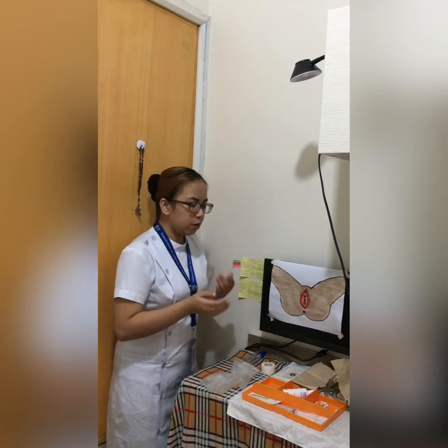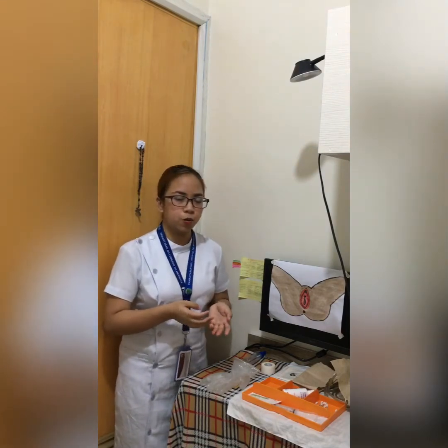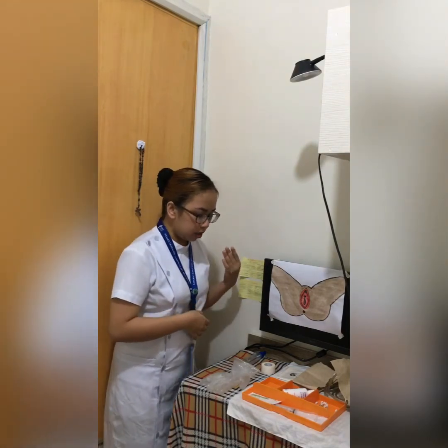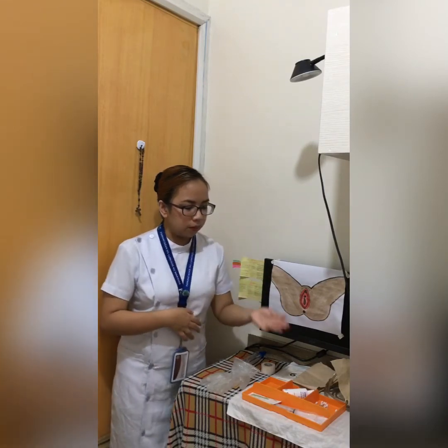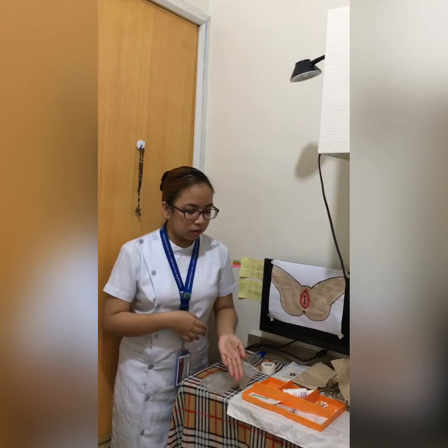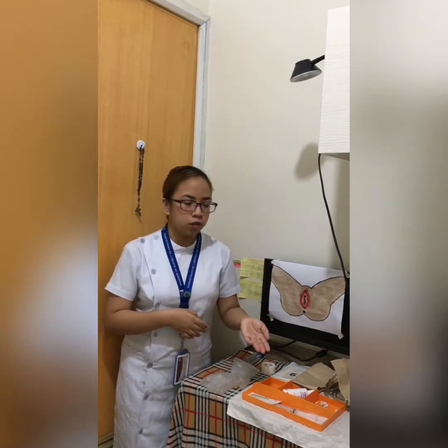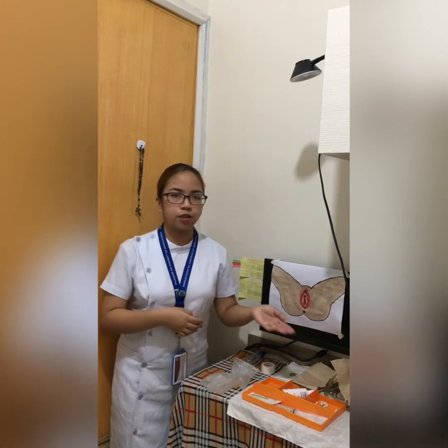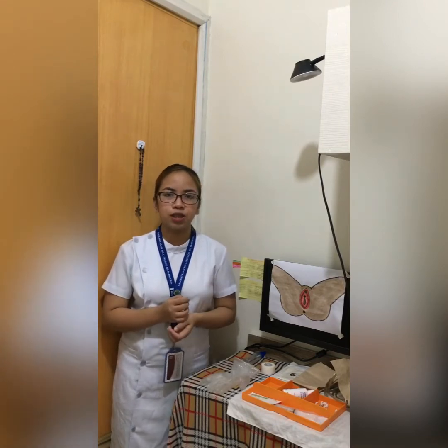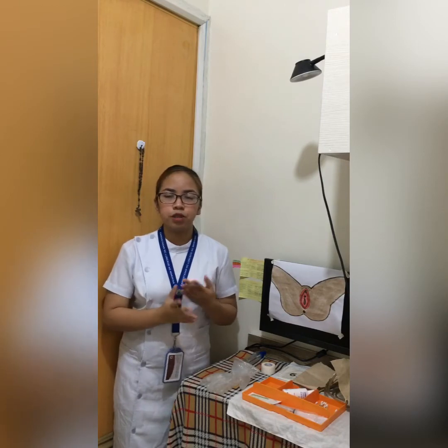Next I'm going to indicate the materials that we're going to need. So we have sterile and non-sterile gloves, a tape, betadine, lubricant, syringe with sterile water, cotton swabs, drapes, and catheter. After that, we have to perform hand washing to avoid the spreading of microorganisms. Next is to greet and identify the client, explain the plan and procedure.